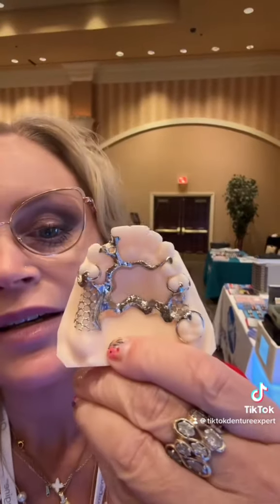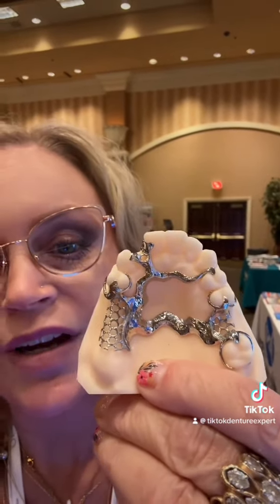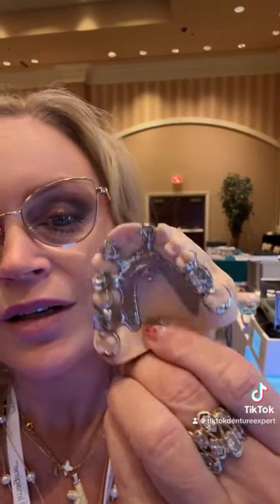Let me just pick up a couple. This is an upper. This one's very fancy. Whoever made these is very, very artistic. Those are absolutely beautiful. This one has some metal teeth in it — very fancy.